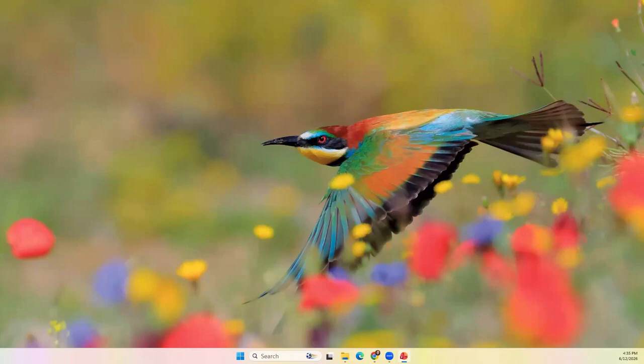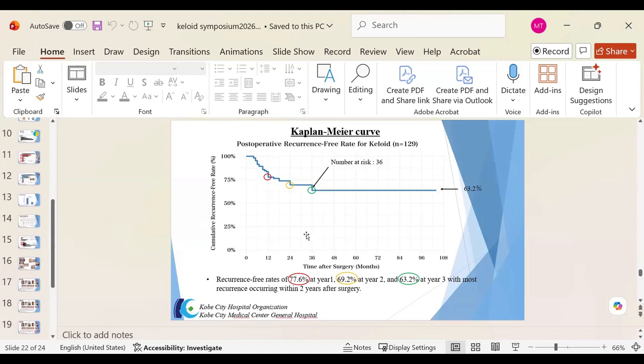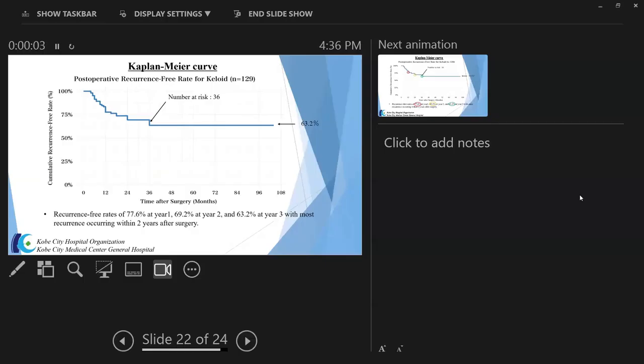It comes down to maybe 20%. That penetrates a little more. But the electron dose at the start is penetrating beyond your target. Those are the two differences, but they're not hugely different. The other thing is the electrons use a bigger field, and people talked about cancer risk and area. If you make a small area maybe a half or 1 centimeter bigger all around, you've doubled the area, and so the cancer risk.